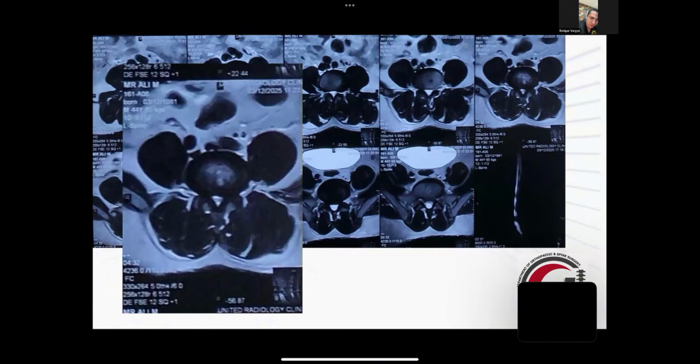I have found I have fewer cases of adjacent disease with endoscopic surgery, even more so for stenosis. And I think that's been a great advantage for these herniations. Yeah, we can expand the life of that adjacent disc, and probably in a lot of cases we can save more surgeries.